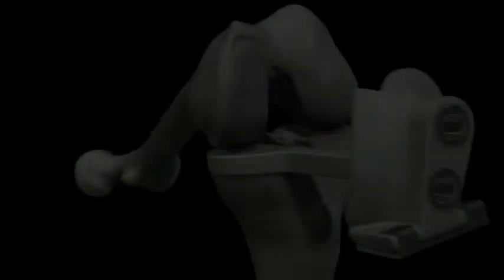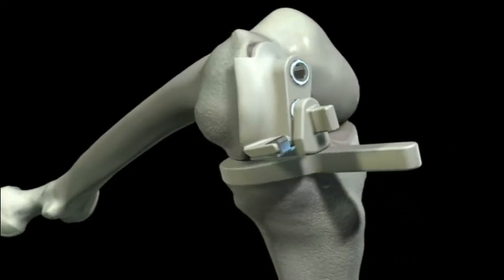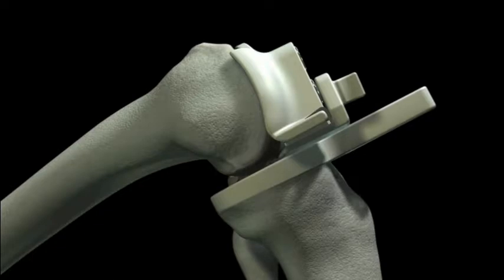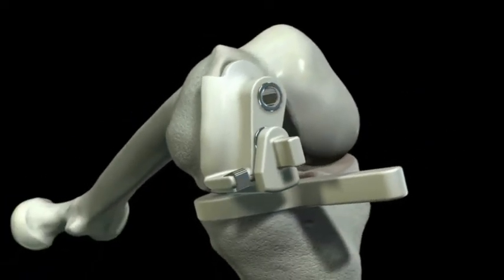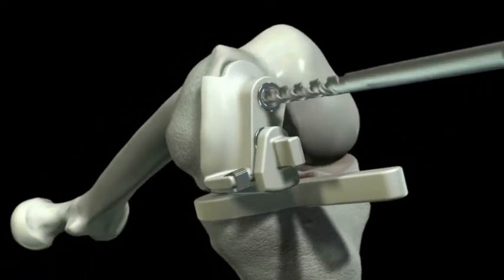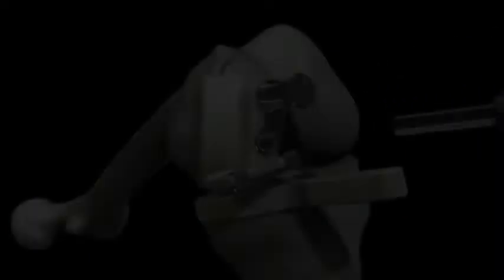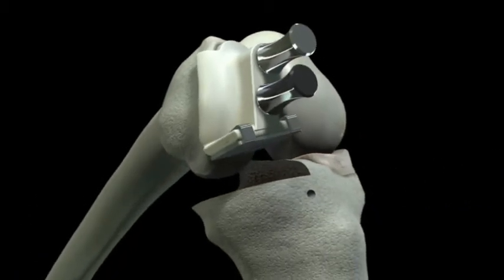Step 4: Femoral preparation. Attach the L-guide to the bottom pinhole on the femoral IJIG and place the assembly on the condyle. Adjust the angle of flexion until the L-guide rests flat on the spacer block while the spacer block touches off on the posterior condyle. Drill and pin the femoral IJIG beginning with the anterior pin first. Make the posterior femoral cut and remove the bone.